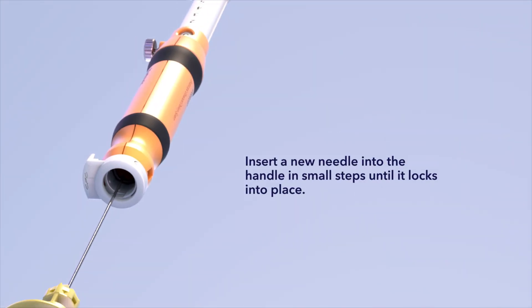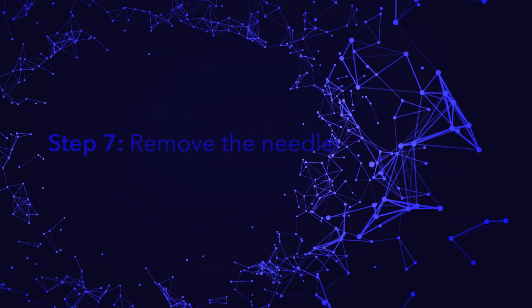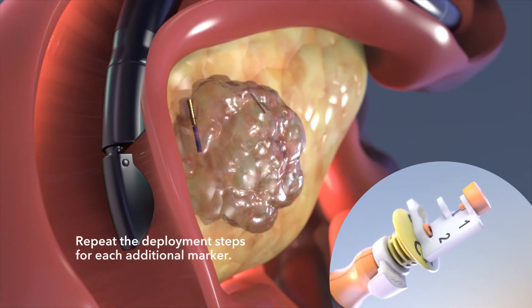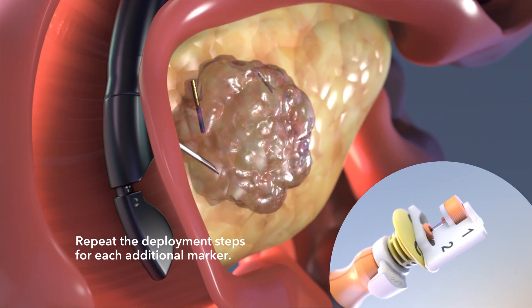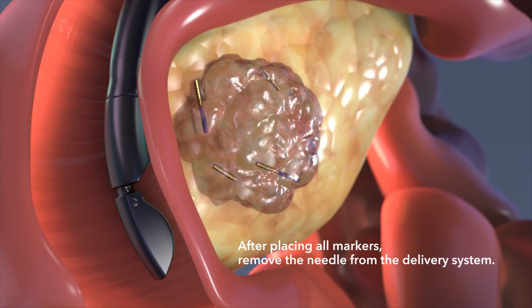The safety sheath is an automatic built-in safety system to reduce the risk of needle stick injury. Insert a new needle into the handle in small steps until it locks into place. Repeat the deployment steps for each additional marker. After placing all markers, remove the needle from the delivery system.